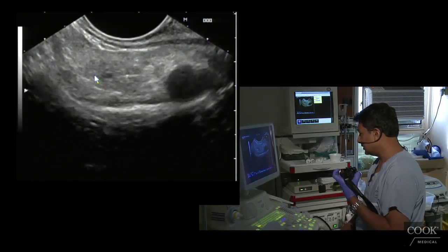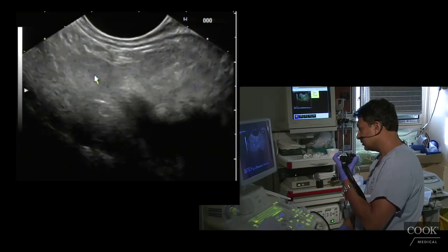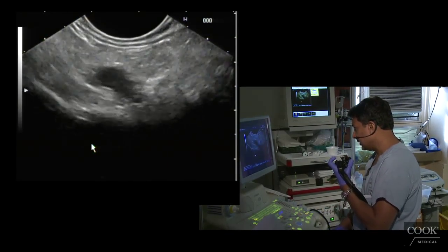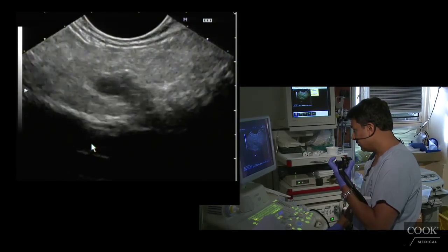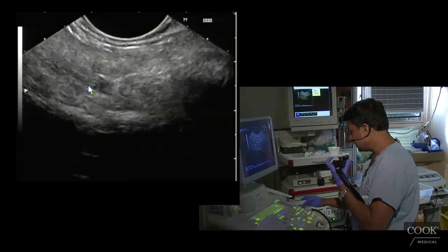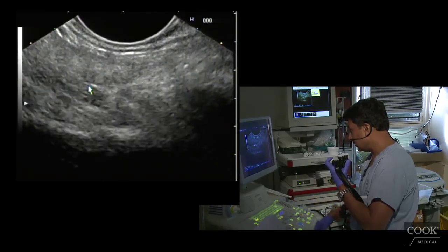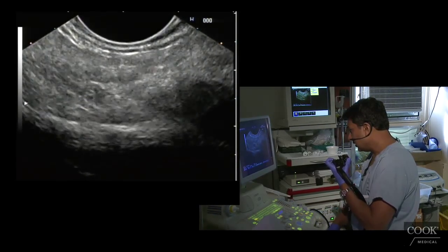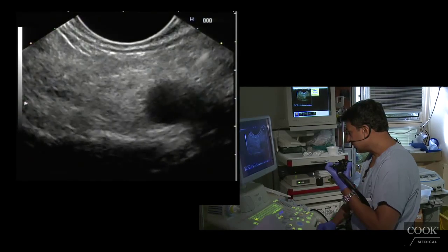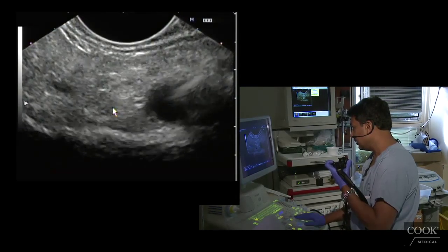Okay, so he has this. I'm going to try and get a long view of this. So that is really an obstructed PD right there that just gets large all of a sudden. And you have to look, maybe you'll see like an early stone or something. But there's clearly something. We lose the duct a little bit right from here to here. We lose the duct.